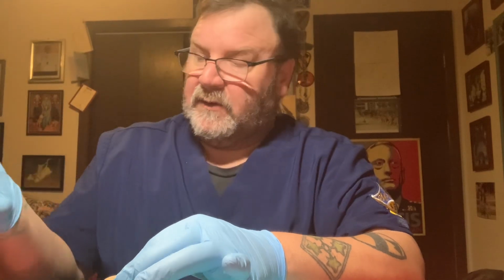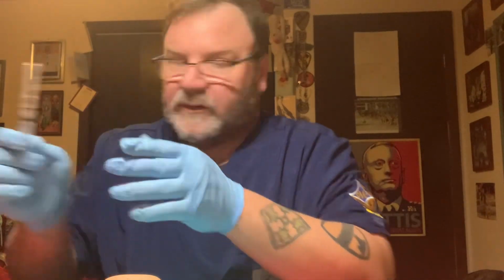withdraw. If the sharps container was here, I would use the sharps container immediately without trying to recap. It is not, so I am going to recap for safety in my home, grasping this down low so there are no errors. Put that in my makeshift sharps.